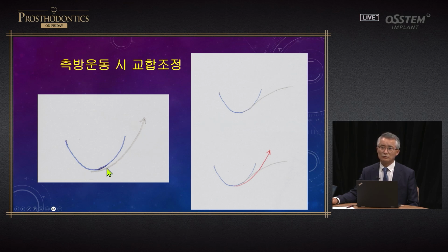As for this patient, movement is possible, but in the case of this patient, movement is not possible because in the initial phase, the tangential angle is too high. Here it's low, here it's high. That's why it's impossible. In this area, we need to focus on it and make adjustments. We need to keep this in mind in order to get good results.